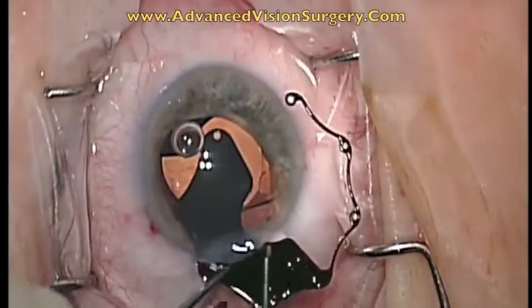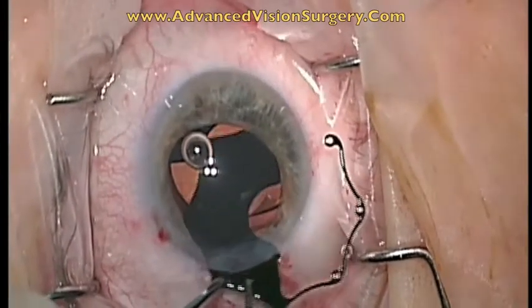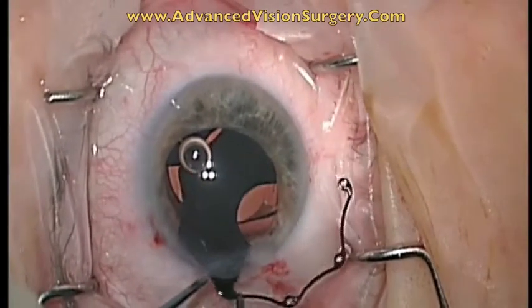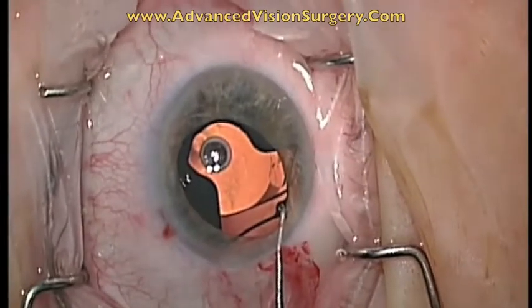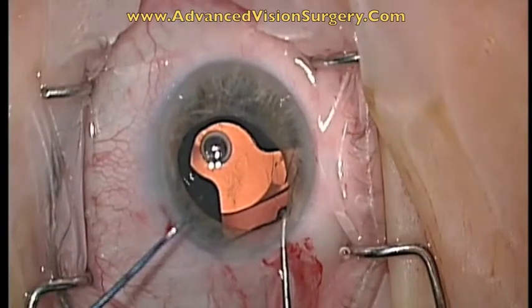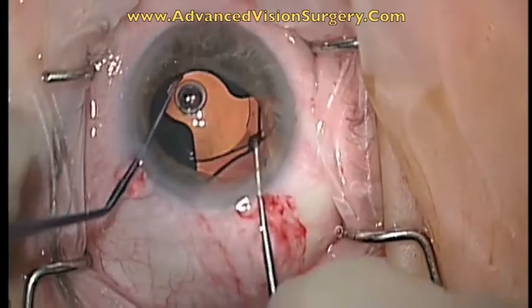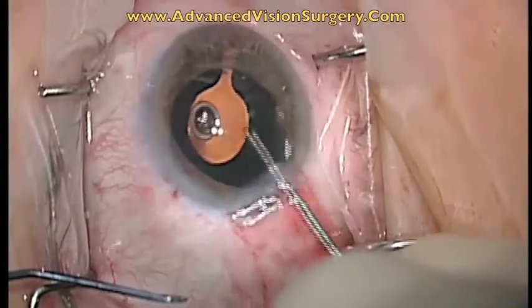The remaining segment is then maneuvered into the anterior chamber in a similar position to the first segment. This is then rotated using a push and pull technique to rotate the second segment opposite to the first, to create a complete artificial pupil.